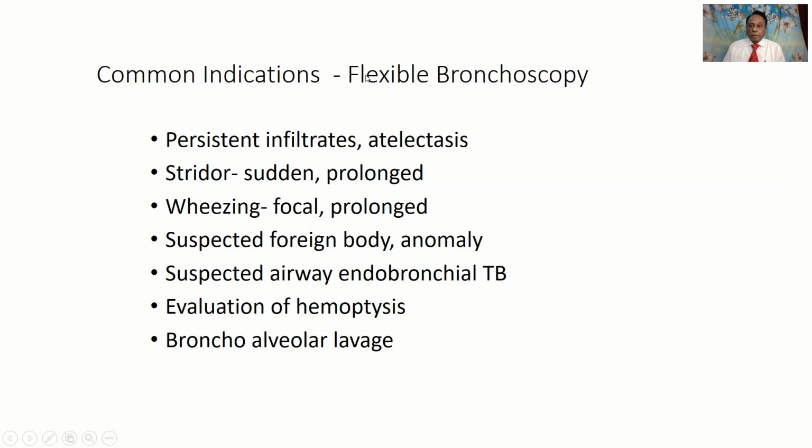Coming to one or two slides about the indications. The common indications for flexible bronchoscopy are these; three things I can say. First is a child having a persistent infiltration in the X-ray, particularly atelectasis or acute atelectasis. These are the children who really benefit from bronchoscopy. Actually, the bronchoscope reopens the atelectasis and they become instantaneously normal.